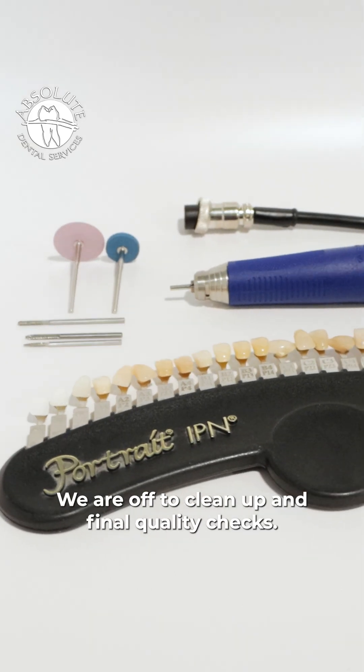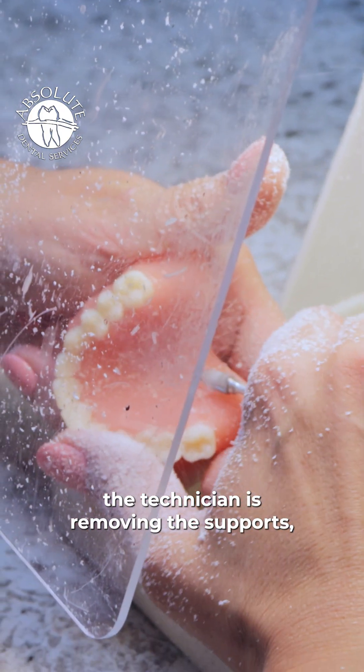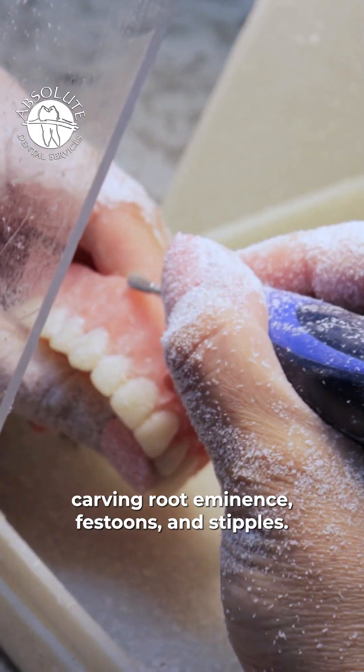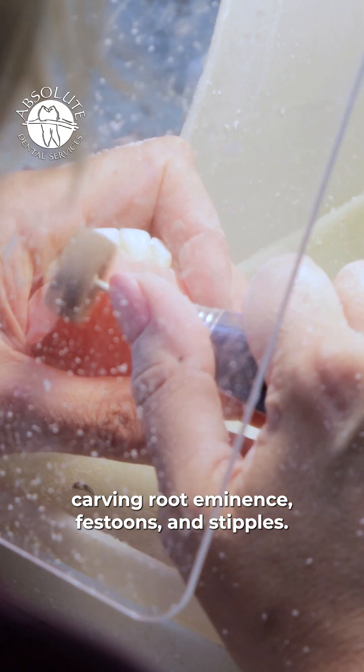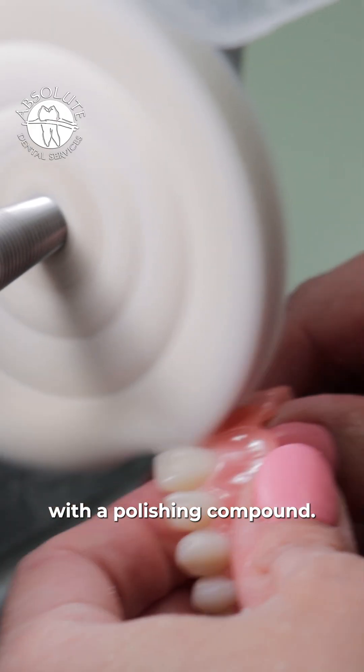We are off to clean up and final quality checks. Here, the technician is removing the supports, carving root eminence, festoons, and stipples. Now, the technician is using pumice to high shine with a polishing compound.